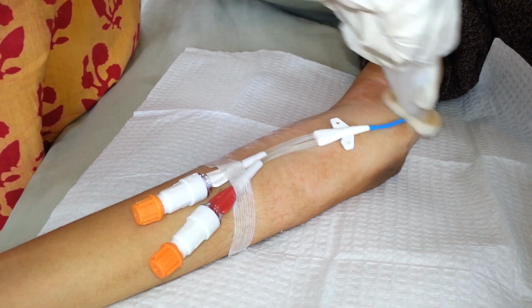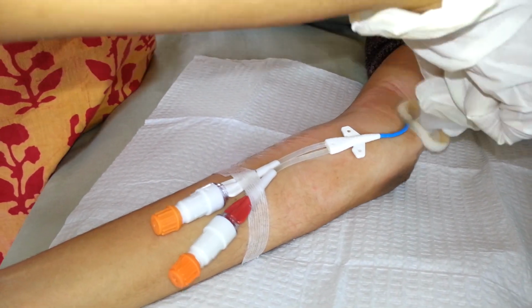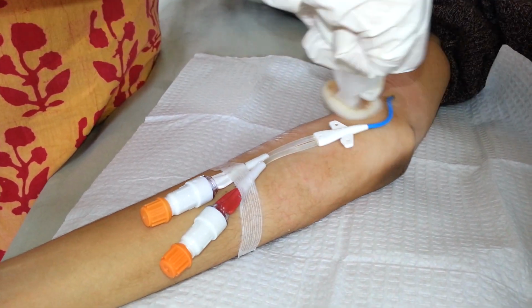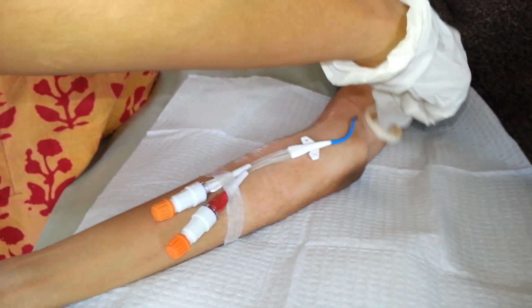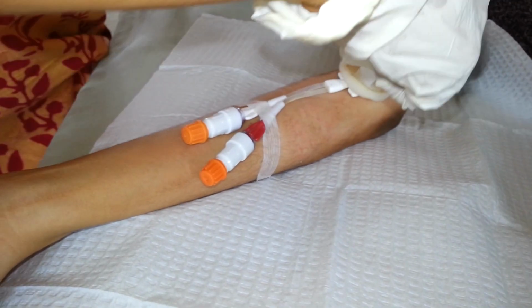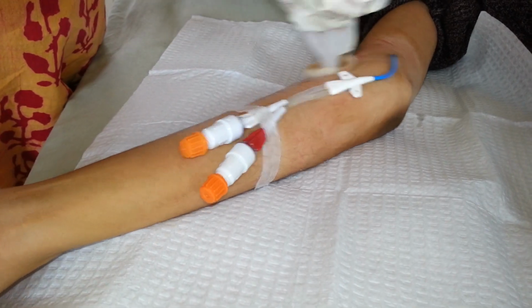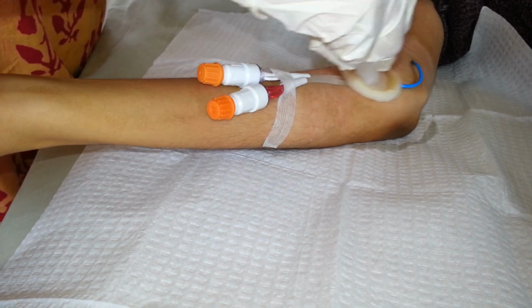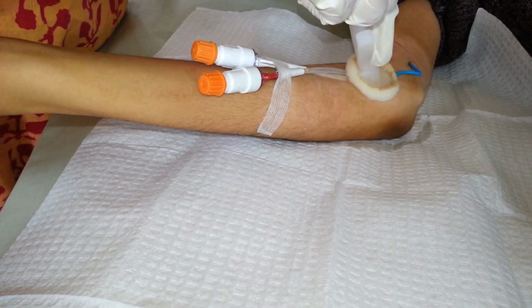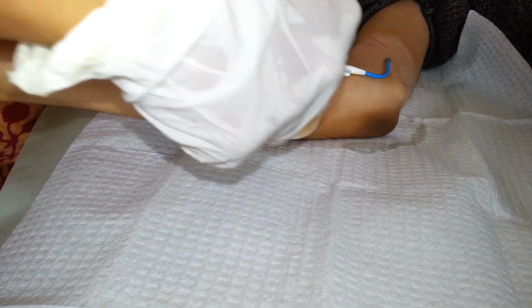Now we will scrub the insertion point back and forth and slowly move outwards, making sure not to touch the insertion point again. We clean the outer area of the site, clean the top and bottom of the catheter and the wing both. Basically, we flip the wing like this and clean it thoroughly so there is no deposit on the wing as well.